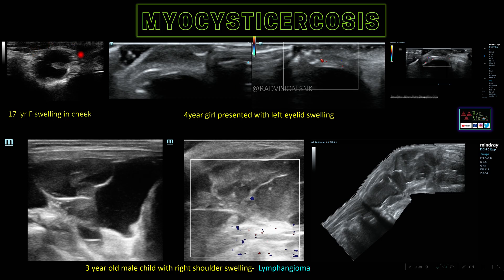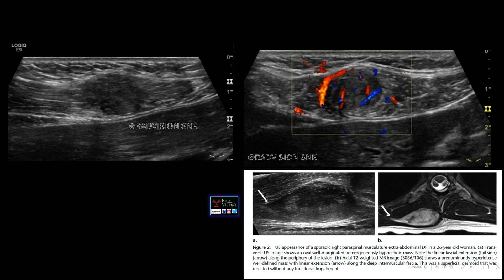Different swellings are shown — one in the cheek and another in the left eyelid. Whenever you see a cystic lesion with an echogenic nodular structure projecting from the wall into the lumen, definitely suspect cysticercosis. In another case, a three-year-old male child with right shoulder swelling shows a cystic lesion with multiple septae and no vascularity on color Doppler — this is a classical case of lymphangioma.